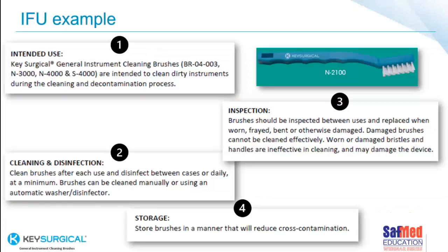Like other implements and medical devices, we need proper brushes made for the right purpose. If you want to clean your teeth, you don't use a shoe brush, you use a toothbrush, right? If you want to brush your hair, you use a hairbrush. You don't use a medical brush or a toothbrush. Brushes are designed for a specific purpose, as is a detergent.